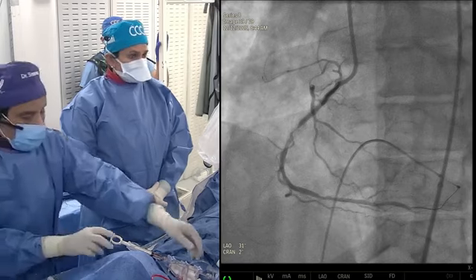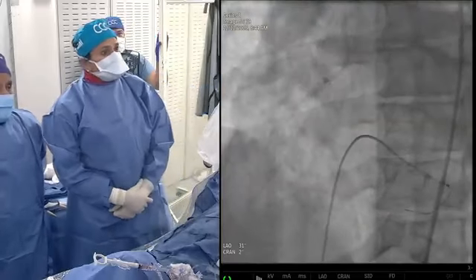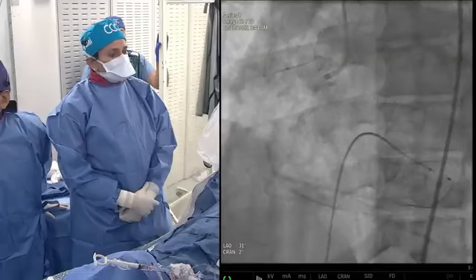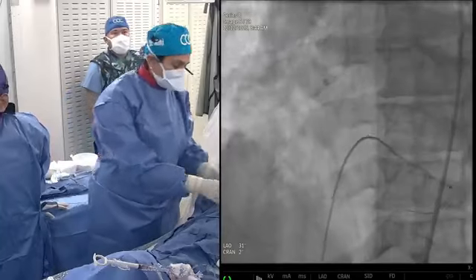Okay, Anu, tell us what your plan is. Now we can show. You have this RCA, proximal, there is no stent, all calcium, severe calcium. And then you actually have a distal lesion also. Question is, what burr size do you want without imaging?